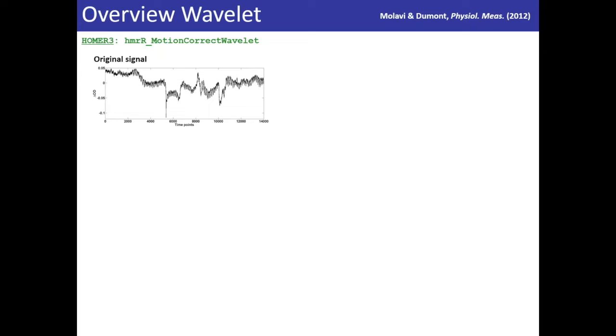Yet another algorithm is wavelet correction. This is introduced by Dr. Molavi and Dumont. So we have our original signal again. It is NIRS heartbeat, but also motion artifacts, spikes, and these slow changes in the signal. This is our original signal.